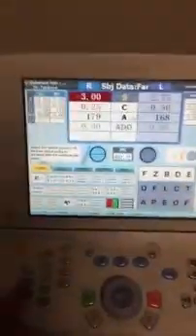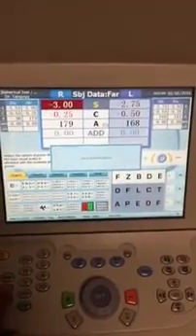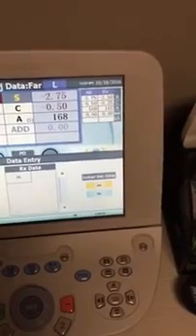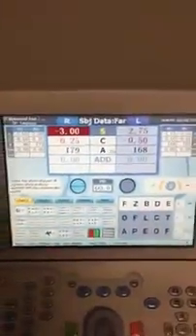Once we do that, it'll auto-populate the Phoropter with that prescription. Now, what I did was I auto-populated it with the AR data. You can switch that if you wanted to through this button right here where it says Initial Set Data. If you want to do the RX to populate the Phoropter, then you would simply tap on RX and then OK.